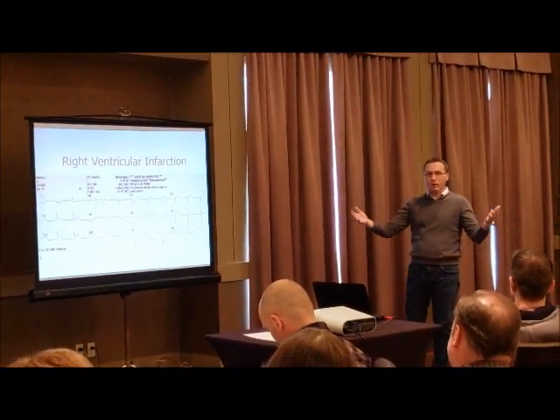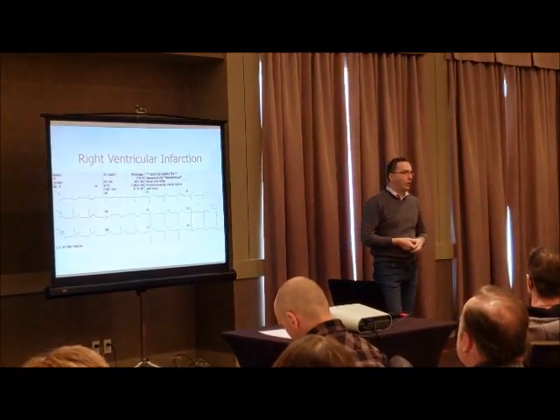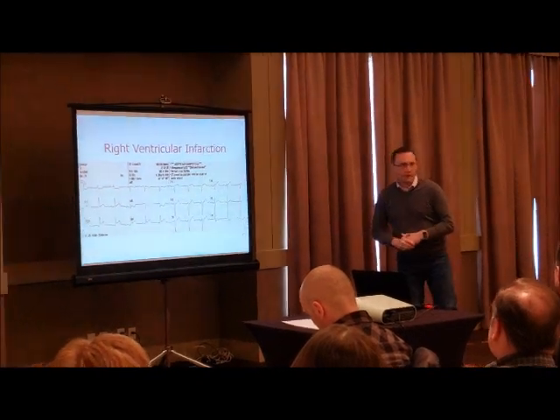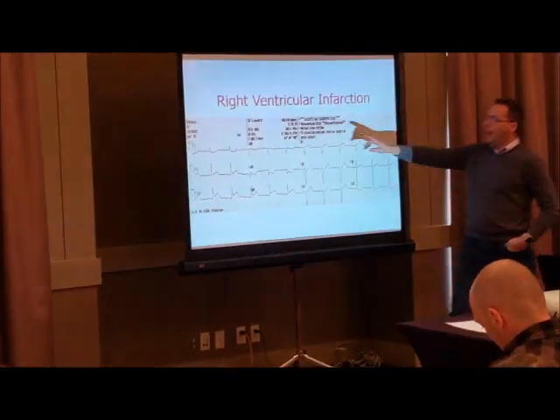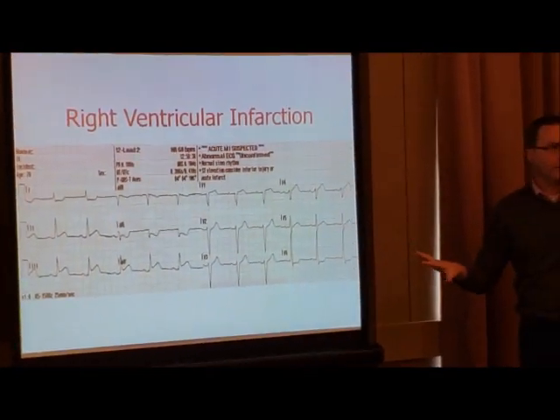It's high. Haven't even hooked her up to the monitor yet. We got high pretest probability. This woman's not her first rodeo with a heart attack. So get her in the back of the ambulance, and this prints off right here. We're gonna run through our little scenario. What's the rate and rhythm? Heart rate is 68. Would you say this is regular or irregular?